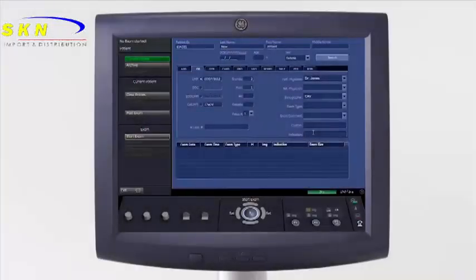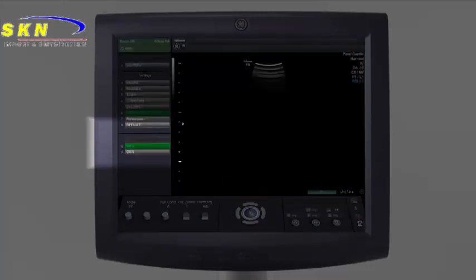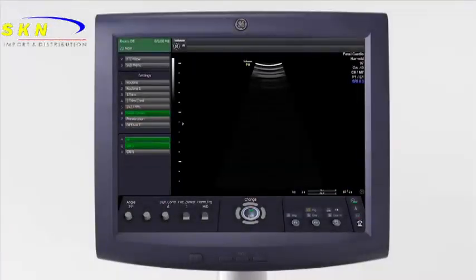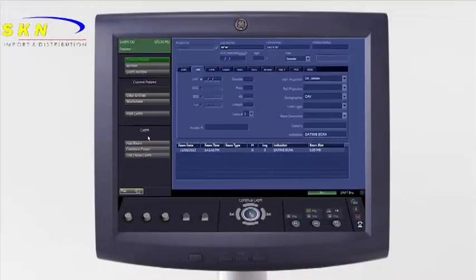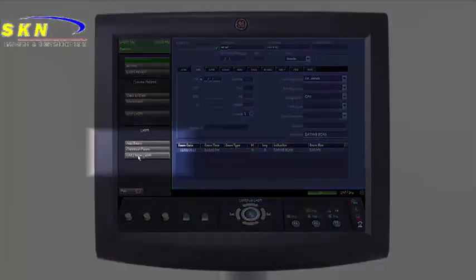All other fields are optional. After entering the required patient information, select Start Exam from the left menu. This will display the imaging screen to begin the exam. Exams are ended using the same patient key, then choosing End Exam from the display menu.